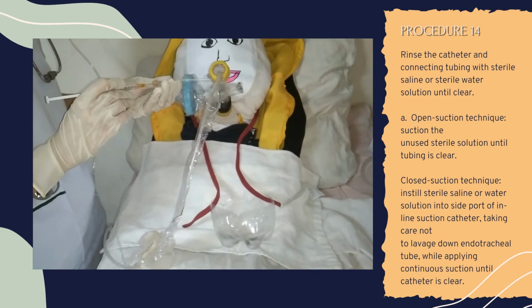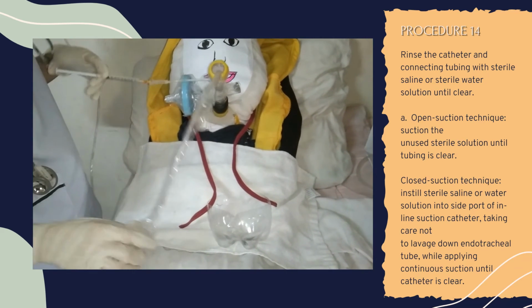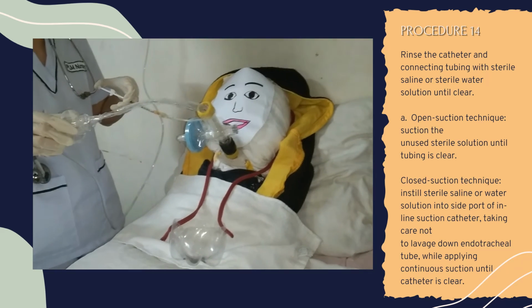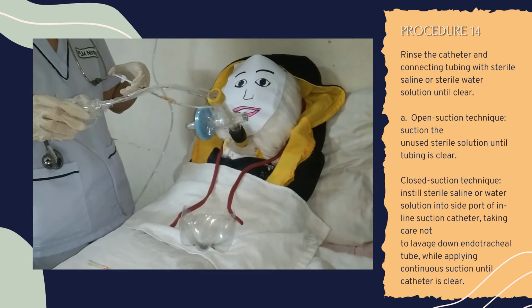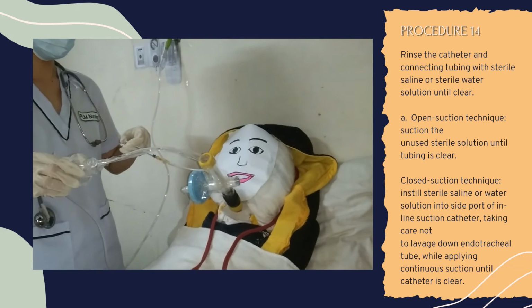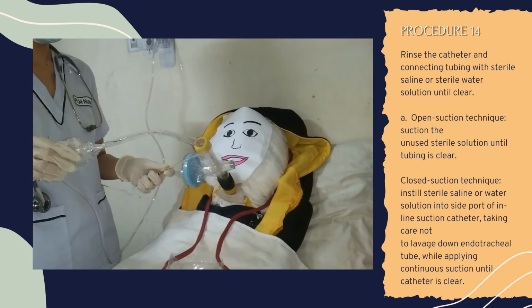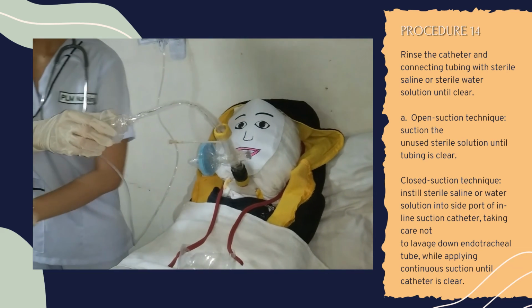In open suction technique, rinse the catheter and suction the unused sterile solution until tubing is clear. In closed suction technique, instill sterile saline or water solution into the side port of the inlet suction catheter, taking care not to lavage down the endotracheal tube, while applying continuous suction until the catheter is clear. Rinsing removes buildups of secretions in the connecting tubing and, with a closed suction catheter system, in the inline suction catheter.